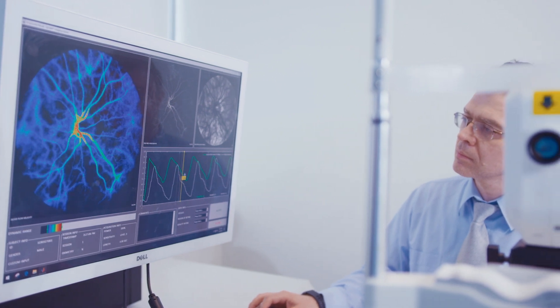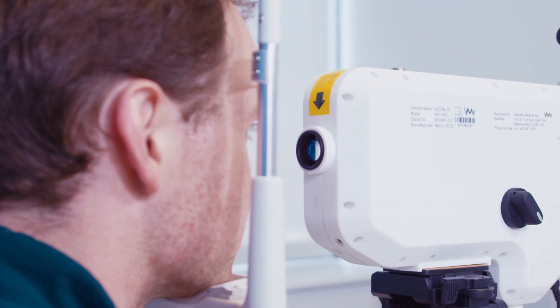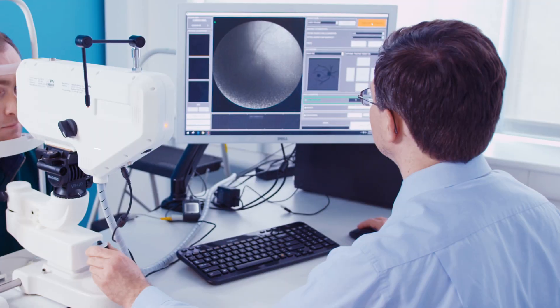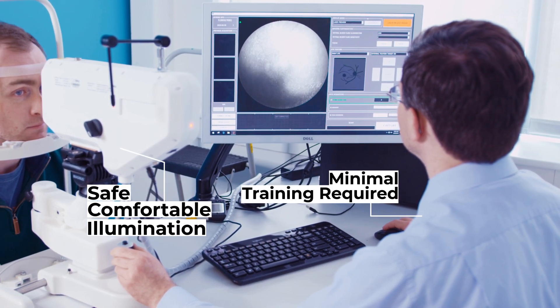The Zycam-RI was designed to make imaging easier for everyone. It's a non-mydriatic imaging system and no contrast agents are needed. Even the patient can get a break from the offensive illumination because the Zycam uses a much more mild, comfortable one.